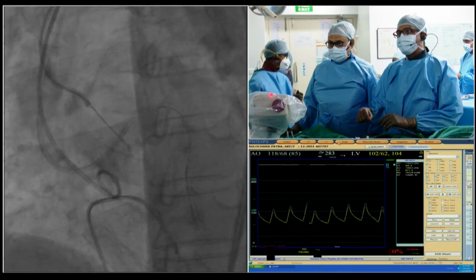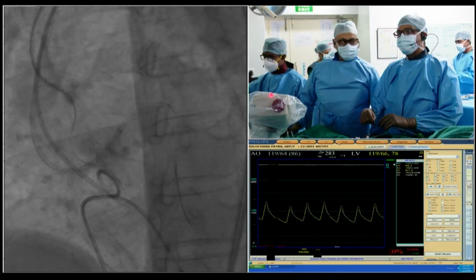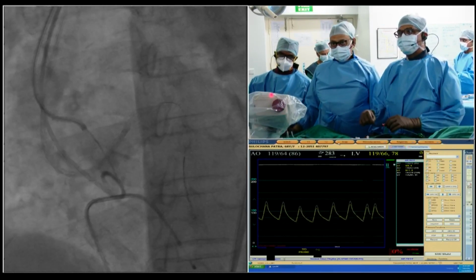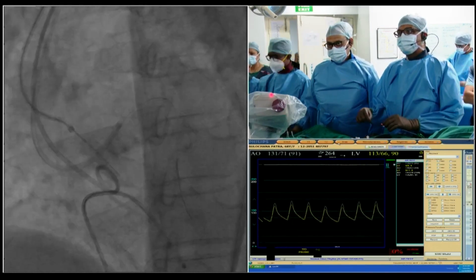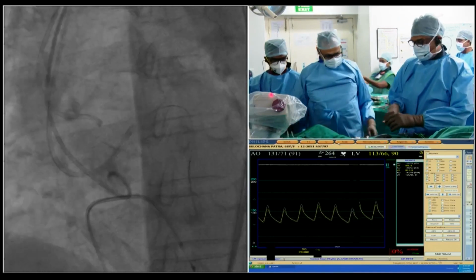2000 heparin. I mean, obviously, there's nothing like that. You can't cross the valve. People say it's just because the valve probably doesn't like the camera, so it'll just cross in a moment. Yeah. Right. I mean, otherwise, don't feel any ego at all, and hand over to Manoj here. You can. 1 meter time.